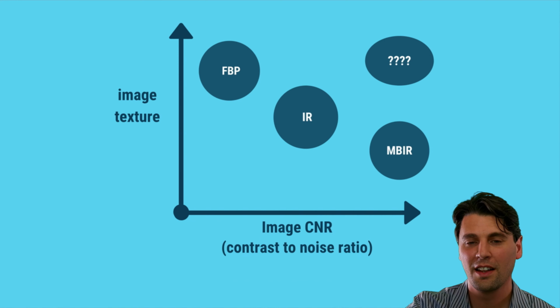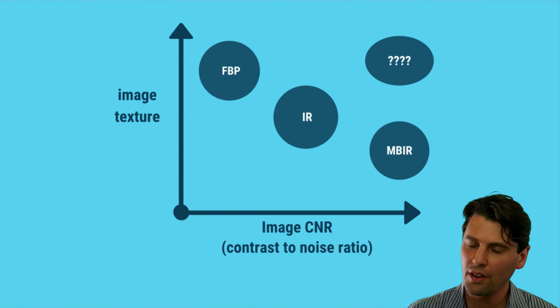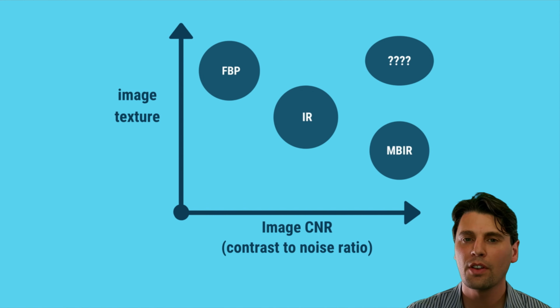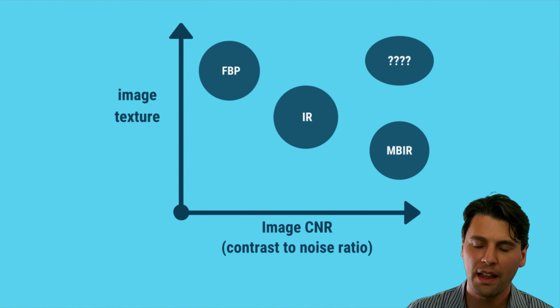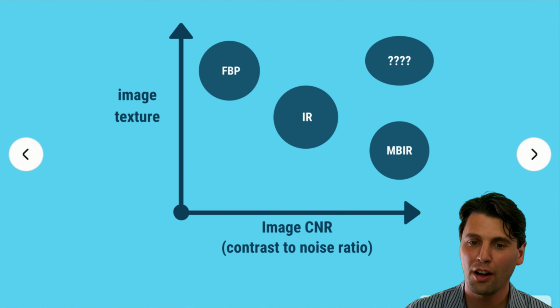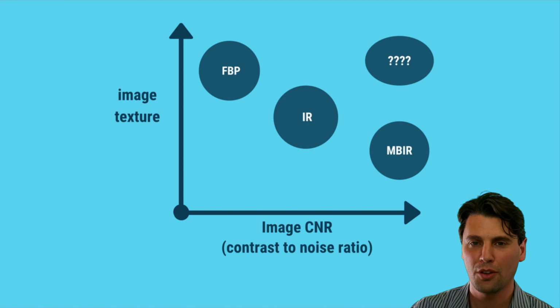At the same time, we were hearing from clinicians that the noise texture in the images was a little bit concerning. The more plastic appearance of some of these iterative reconstructions was concerning. So there was a desire to have a method that, while going fast in terms of the reconstruction time, also we wanted to have it have a contrast to noise improvement like we talked about at the same image texture roughly as filtered backprojection. Filtered backprojection, again, being basically the standard that everyone in the industry has been used to.